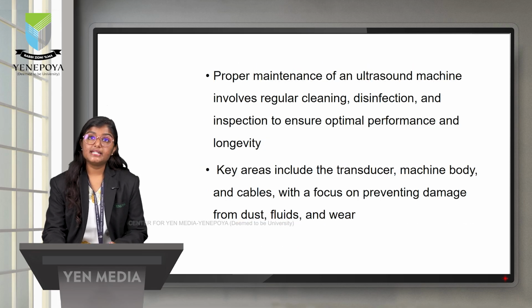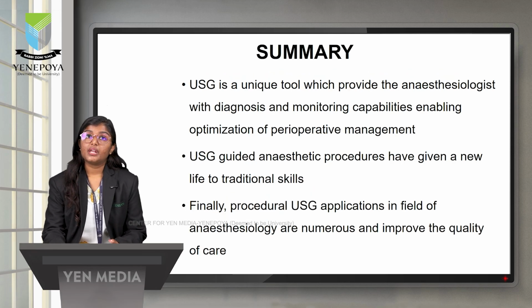Proper maintenance of ultrasound machines involves regular cleaning, disinfection and inspection to ensure optimal performance and longevity. Key areas include the transducer, machine body and cables, with a focus on preventing damage from dust, fluids and wear.